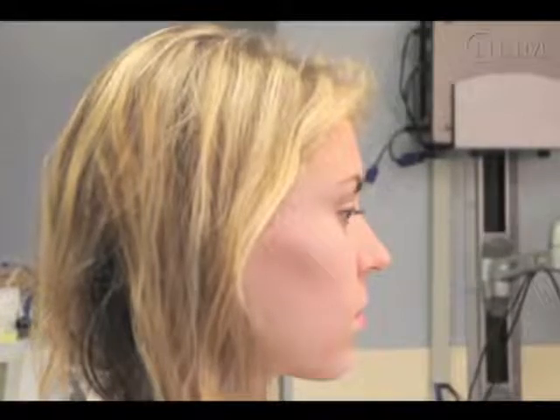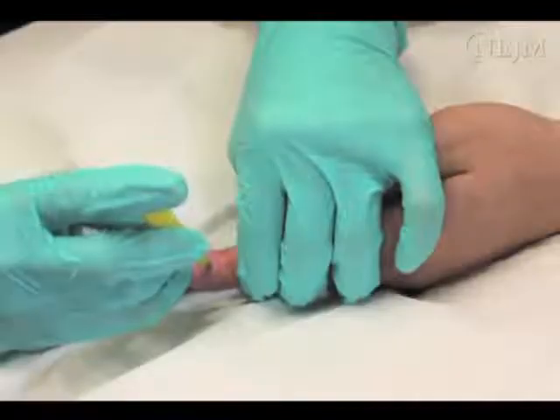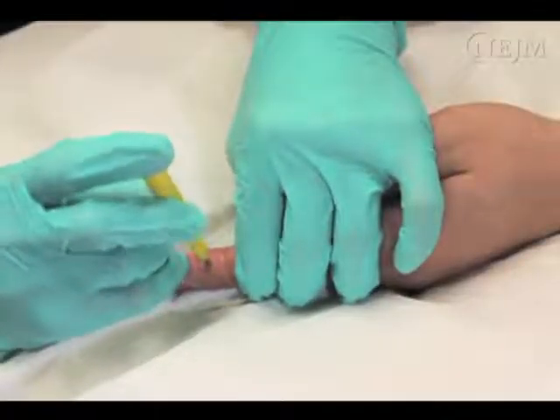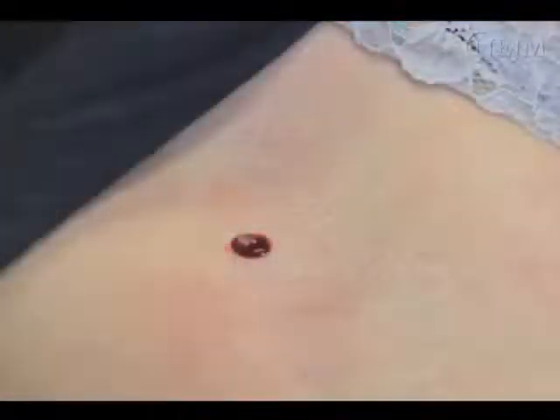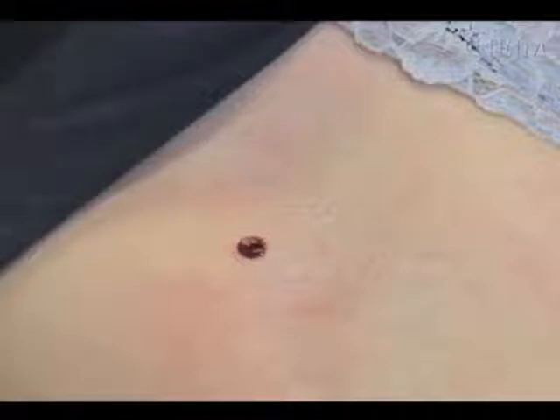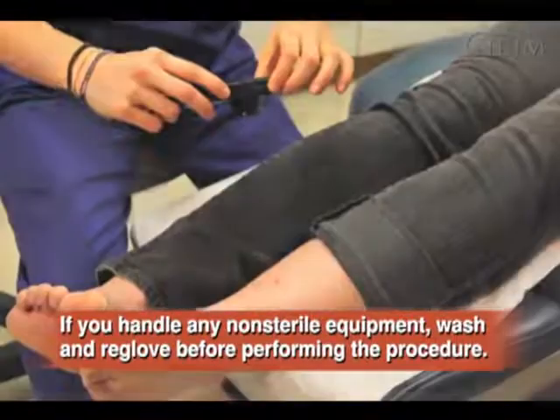Biopsies performed on the back can have poor aesthetic results because the scars may stretch. Avoid doing punch biopsies on the face whenever possible. If obtaining a specimen from the face is unavoidable, scars behind the ears, under the jaw, and at the hairline are the least visible. Plunging a biopsy punch into the temple, a finger, or the jaw may result in substantial injury to a nerve or artery. It is also possible to lose a biopsy site once it heals, so taking a photograph of the marked biopsy site with the patient's consent is recommended.